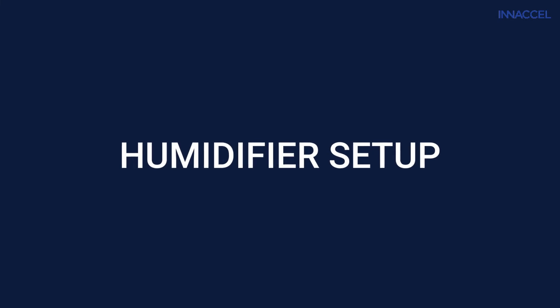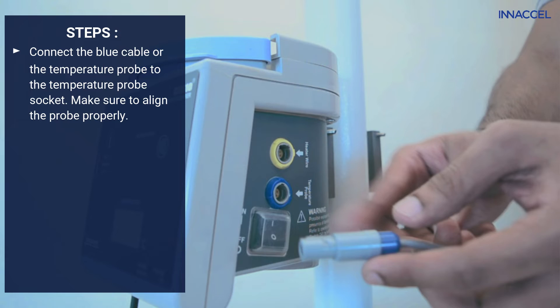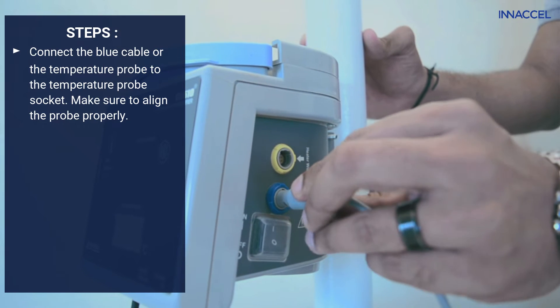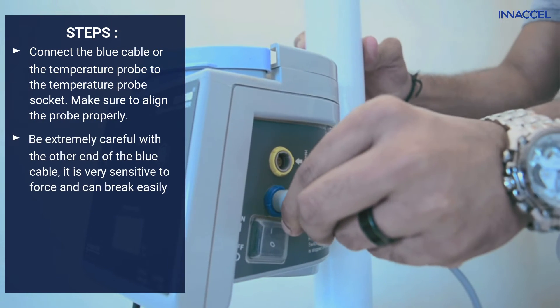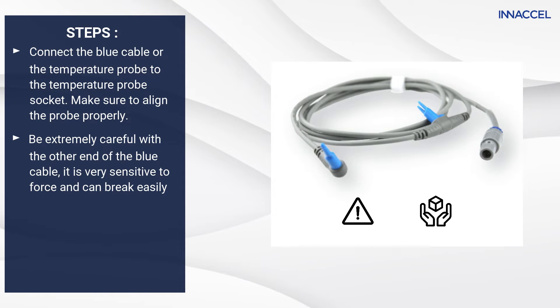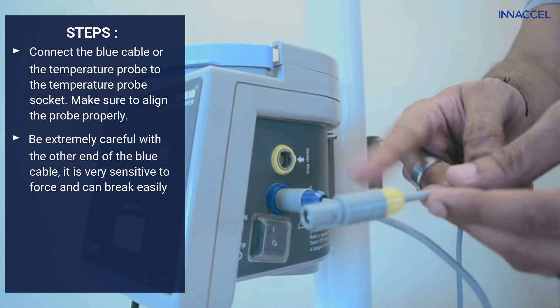Now move on to the humidifier setup. Connect the blue cable, or the temperature probe, to the temperature probe socket. Make sure to align the probe properly. Be extremely careful with the other end of the blue cable, as it is very sensitive to force and can break easily.